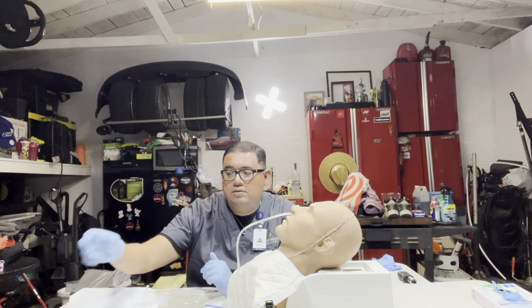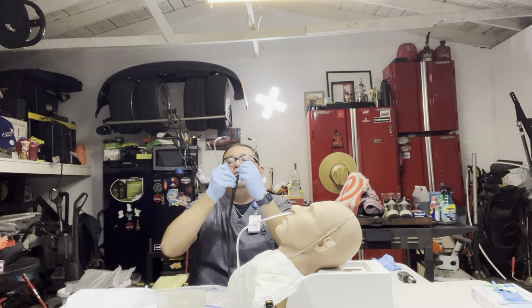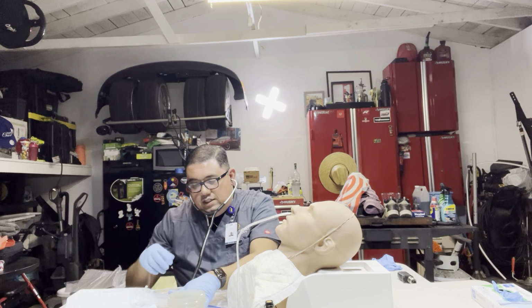Next, if needed, if we didn't have pH paper or anything like that, we can also check for placement by using our stethoscope. So I'll place my stethoscope on the patient's abdomen, stomach area.